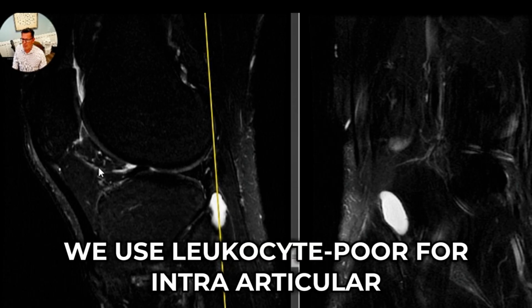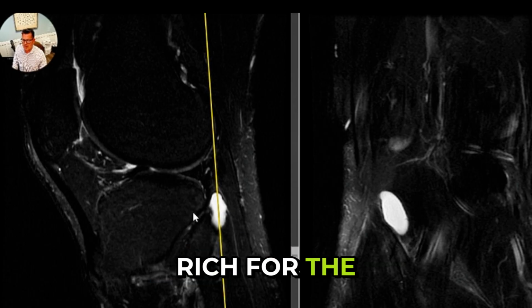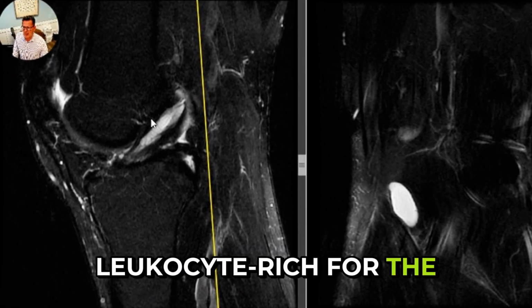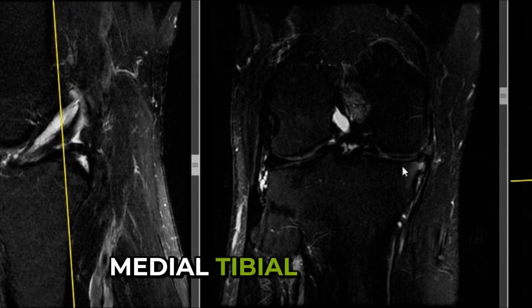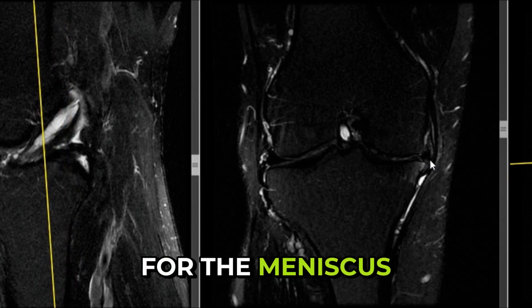We use leukocyte-poor for intra-articular. We use leukocyte-poor and a little rich for the tib-fib joint. I used leukocyte-rich for the ACL. Then we did a little intraosseous injection for this medial tibial plateau. Leukocyte-rich for the disc, for the meniscus, as well.